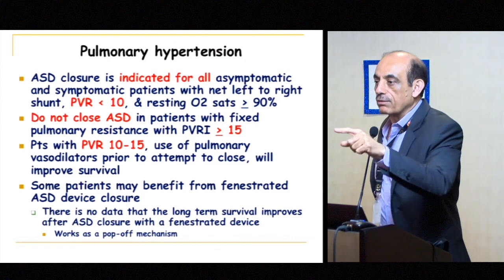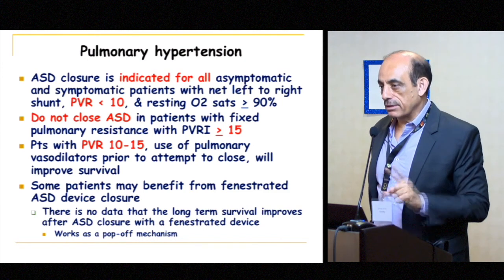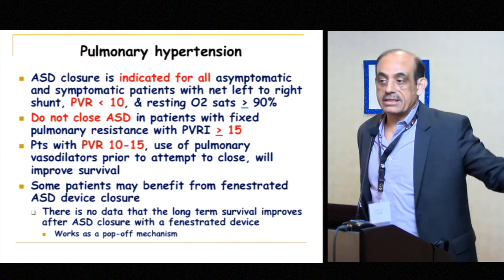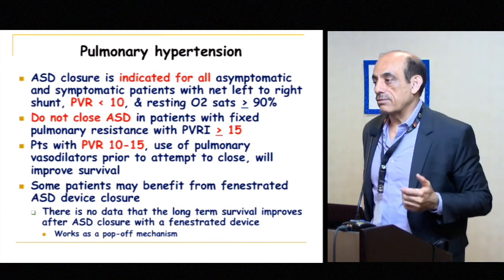One thing I wanted to mention before we finish is to be aware of the eustachian valve. I know I didn't talk about it, but that can really mess up the situation sometimes if it's a very, very long eustachian valve. People may not even recognize where the true defect is, because of where the eustachian valve is.